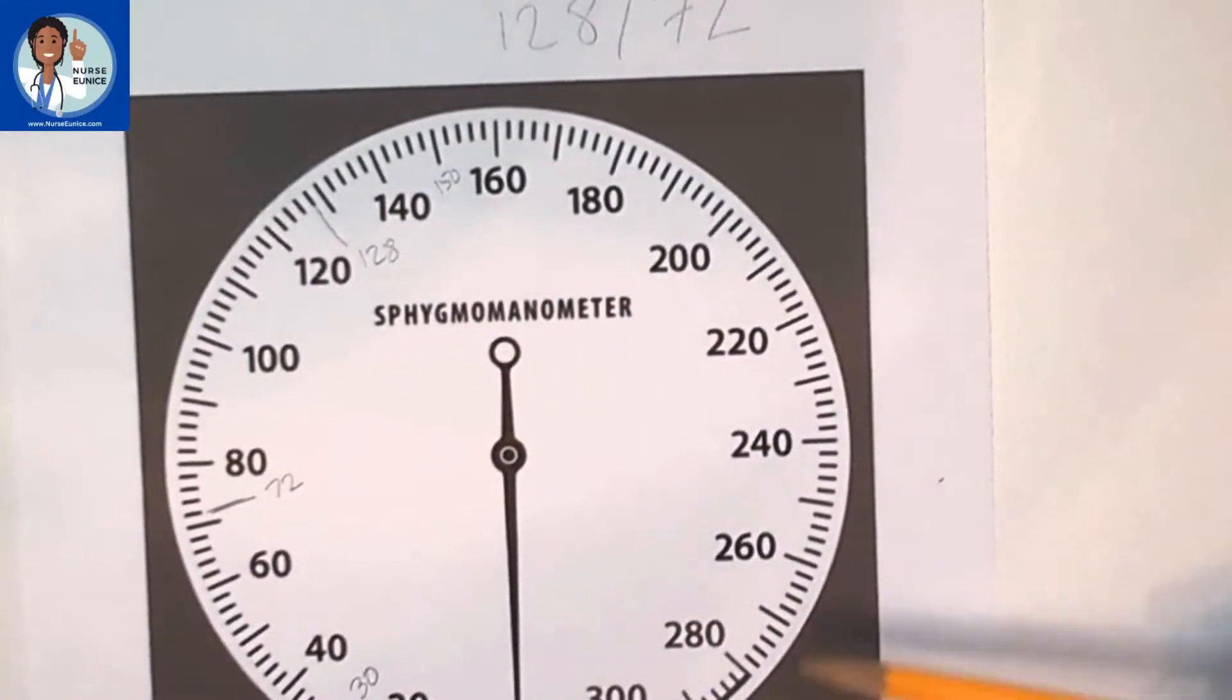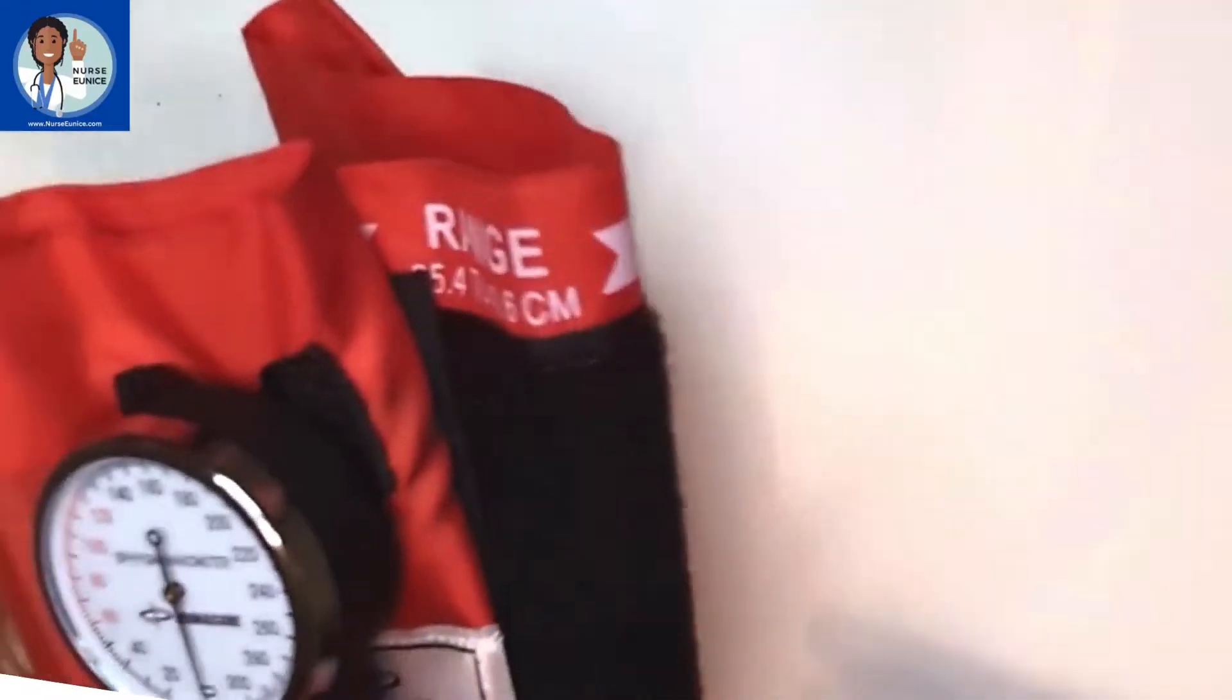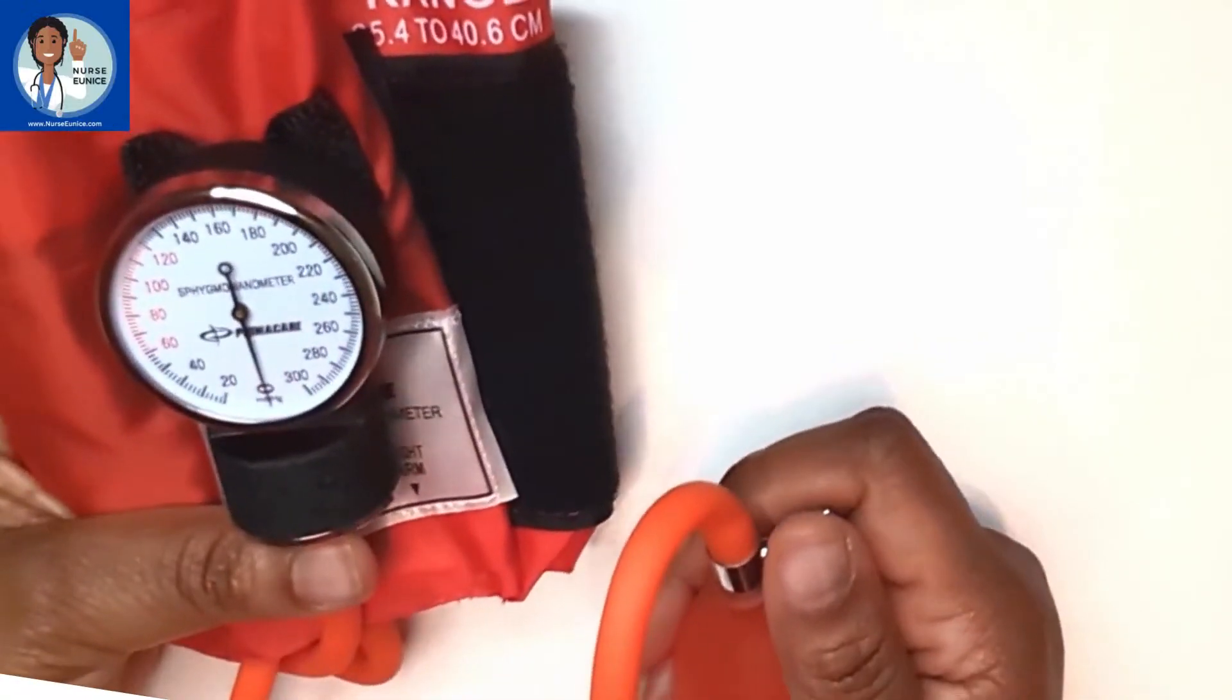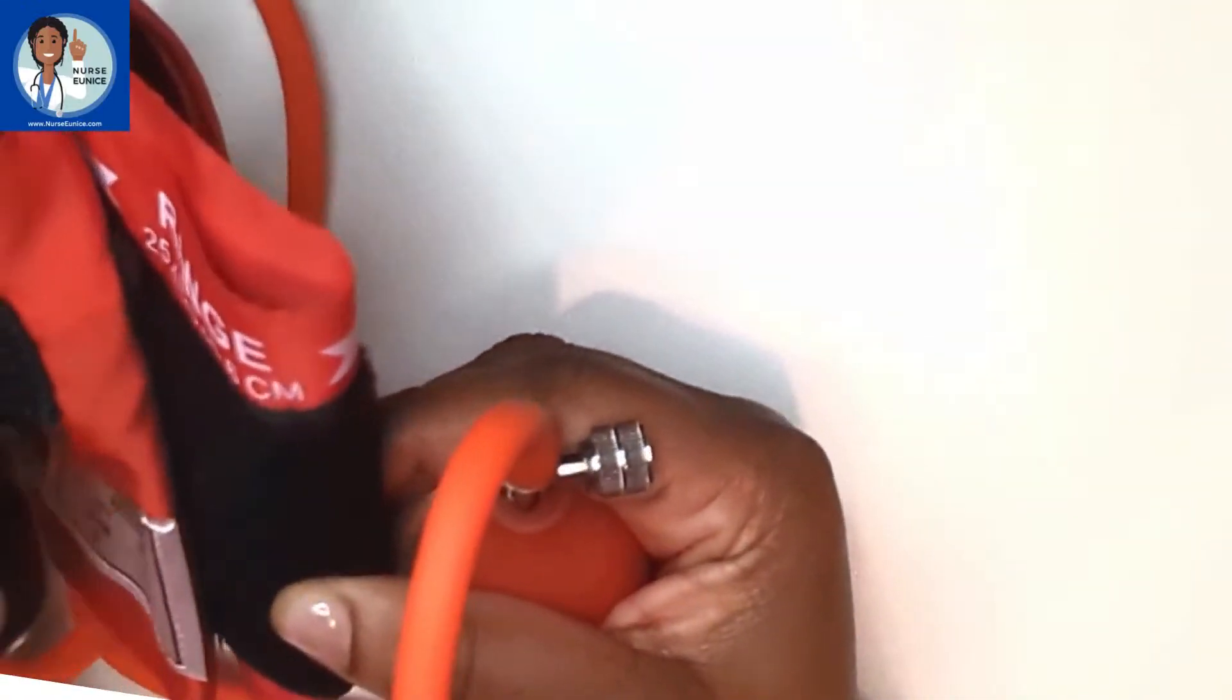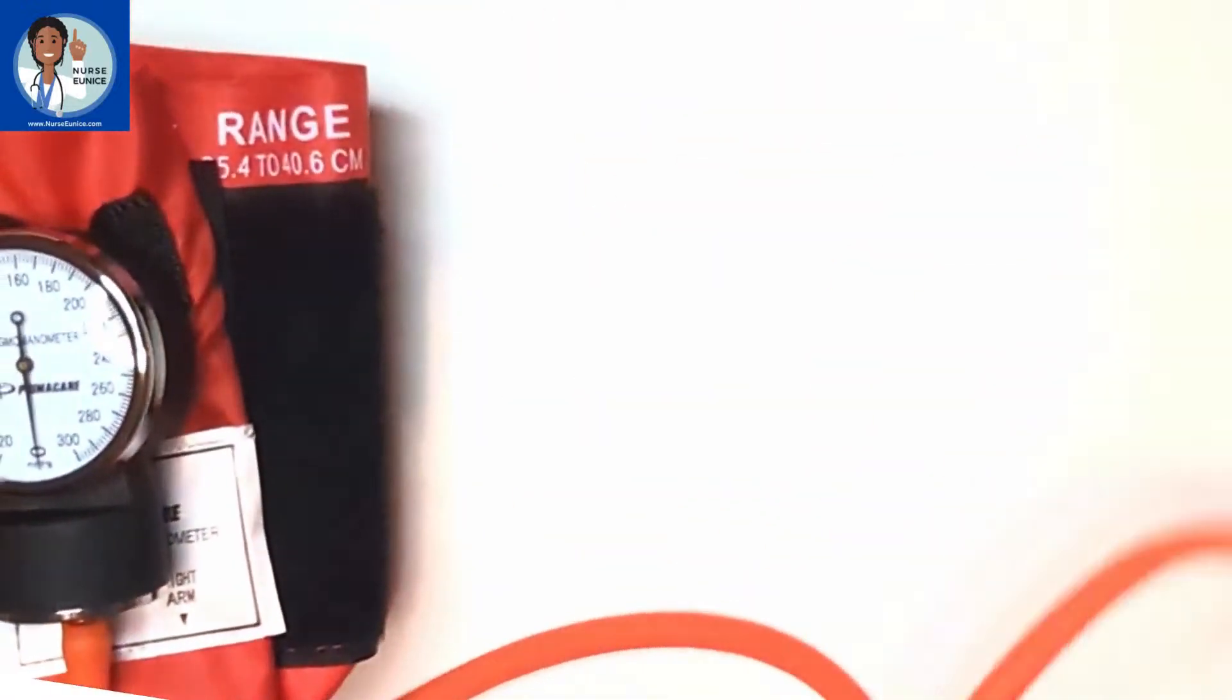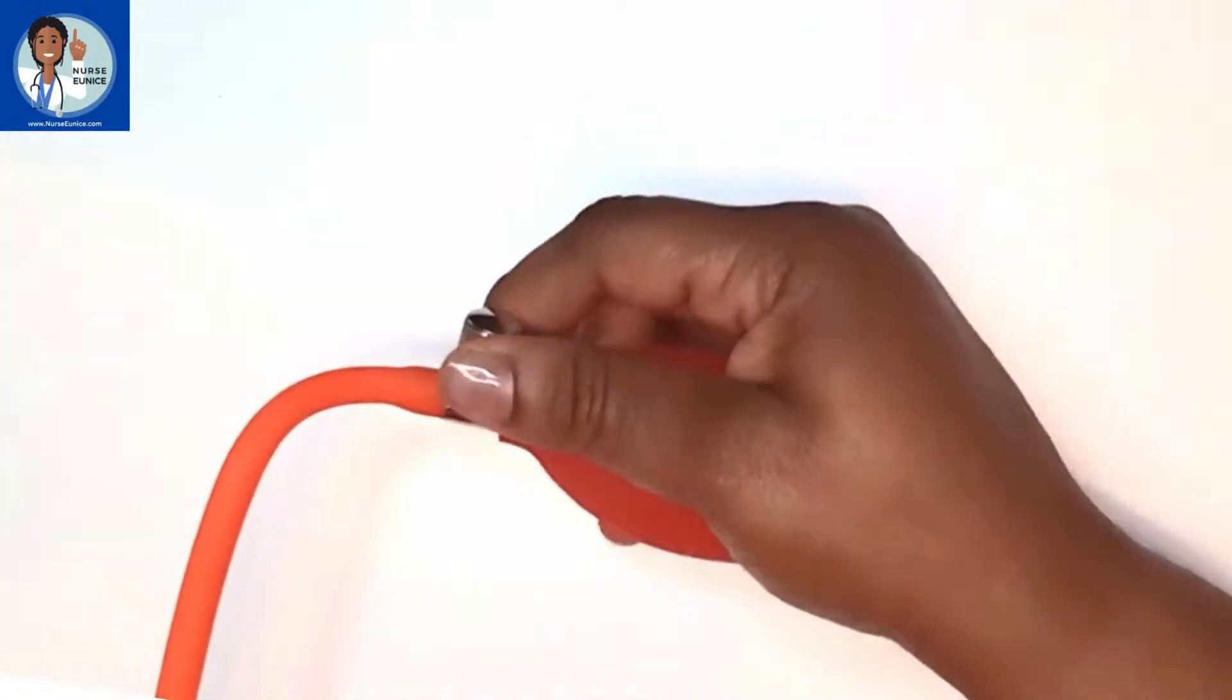Now let's put it all together. We know how to read the gauge. Whenever we're practicing, I always ask that you practice without an arm in the cuff until you know what you're doing. I just have the cuff wrapped on itself. We talked about this bulb. We have the air valve here.